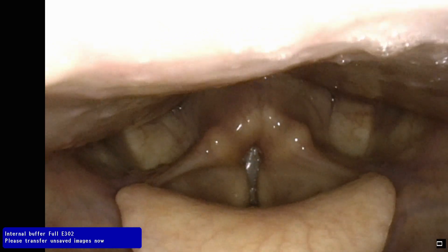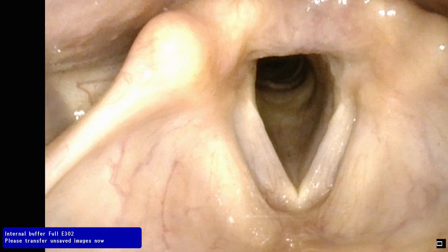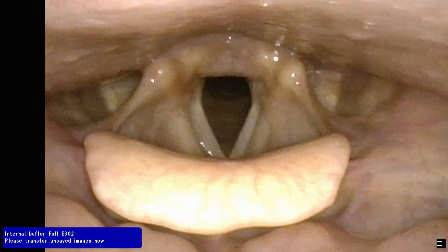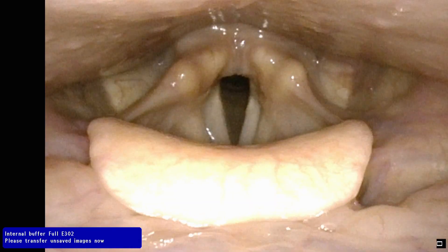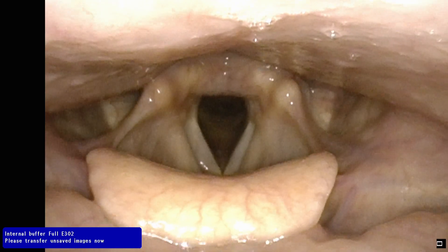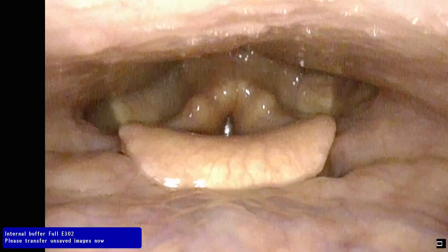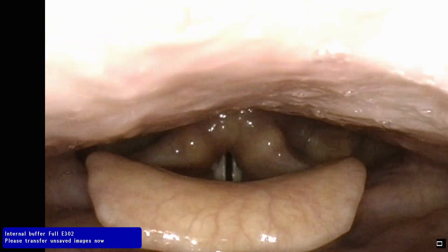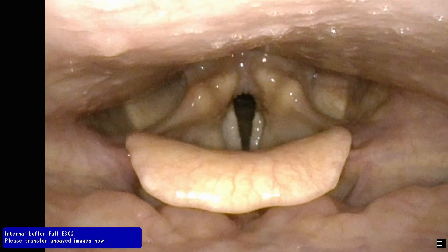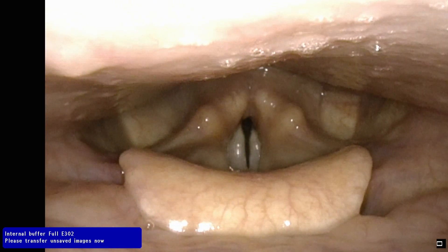So see there, we've got a little bit of that epiglottis engaging, but not very much of that pharyngeal wall like we saw before. I'm going to show you the ventricular folds. So on either side of the vocal cords — those are your ventricular folds. Those really aren't engaging very much, I would say. I think it's mostly your tongue and your pharyngeal muscles that are engaging. The ventricular folds aren't engaging a whole lot. Do you want to sing — it can be literally anything, it doesn't even have to be words. Sing a little something. Do, re, mi, fa, so, la, si, da. See how there we couldn't even see your vocal cords really because the epiglottis tracks so much — that's that tongue really engaging. But again, the ventricular folds aren't super engaging very much. A lot of the tongue and the pharynx.